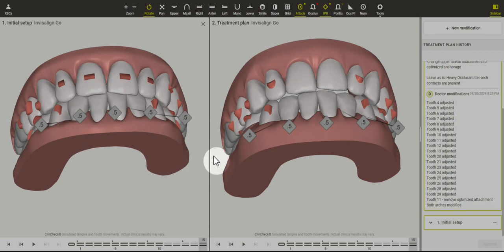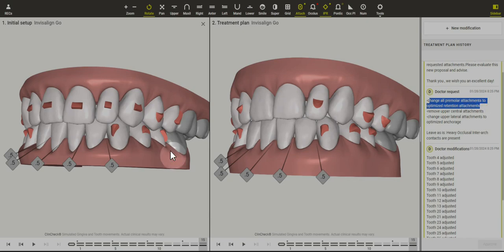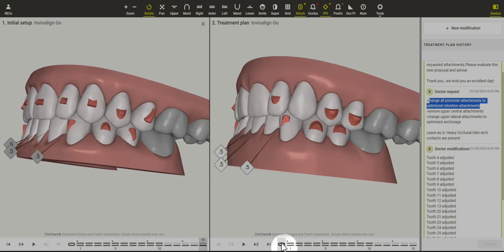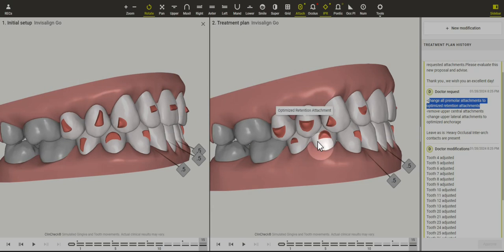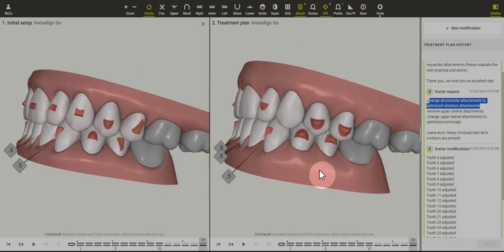We were able to achieve this by eliminating the upper extrusion, which wasn't really needed for this case. I can also see that you had asked to change the premolar attachments to retention — that is absolutely great — but we do need to remember that when we ask to change the attachments, unfortunately it doesn't change the underlying movement, so we can still see these premolars rotating.